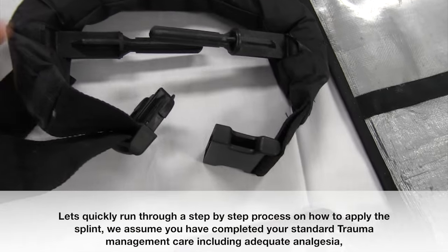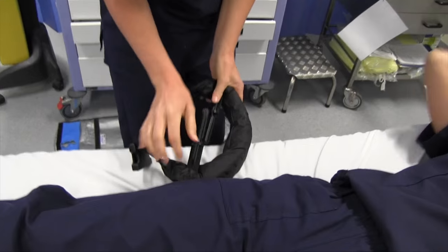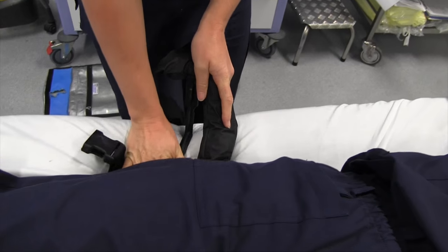Let's quickly run through a step-by-step process on how to apply the splint. We assume you have completed your standard trauma management, including adequate analgesia.